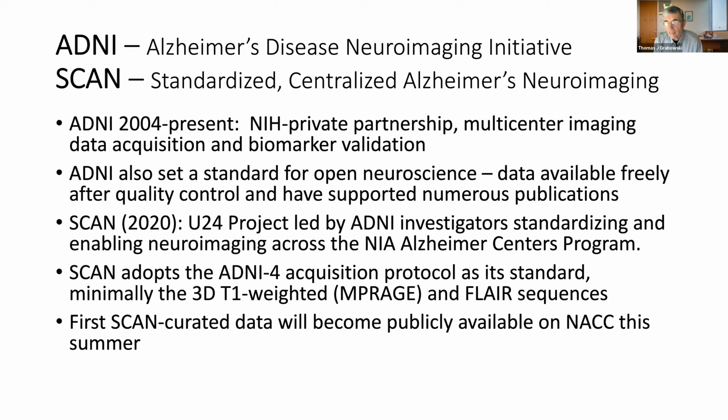So it's an important thing in the imaging field that there are these large public data sets that are available to you as an investigator, as much as any other investigator in the world. A lot of questions have been asked or generated using ADNI data. So that's something you should know about.